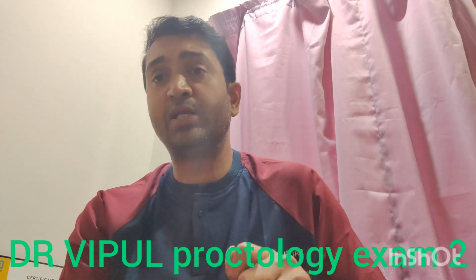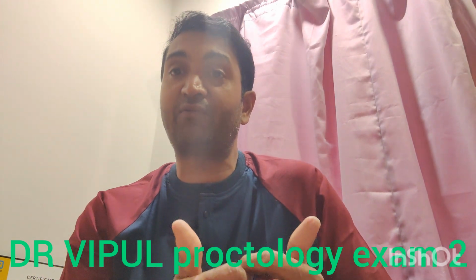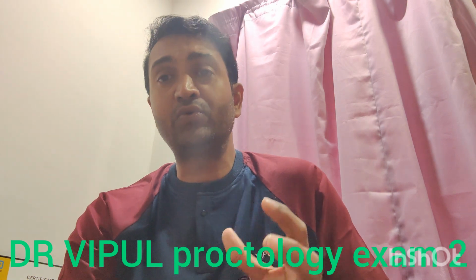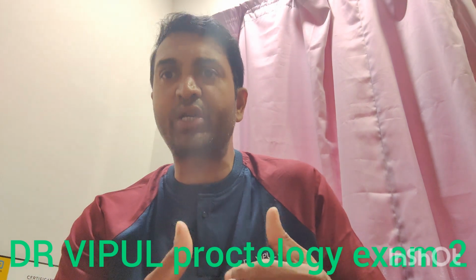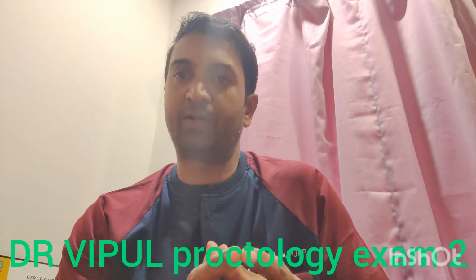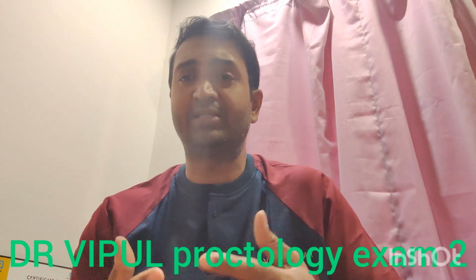As well as, slow proctoscope withdrawal is very important, like a colonoscopy. During the withdrawal you will get a definite clue about the disease. So during the withdrawal, if you see a congested bluish or purple colored mass protruding inside the proctoscope, these are the piles, while the pinkish color ones are the mucosa. So with slow withdrawal till the anal verge, you will get the diagnosis of piles.